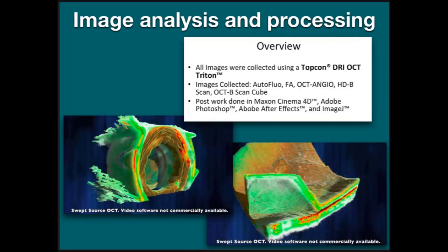Here's some from the Topcon Triton OCT angiography system. And again, you look at these beautiful images, but if you look at the fine print, it says post work was done with Maxon Cinema 4D, Photoshop, After Effects, and Image J. And you'll notice on the images, they'll put a note on there that this is not actually commercially available at this time. So you'll see a lot of pretty images around, but not all of them will come out of your OCT. Not yet anyway.